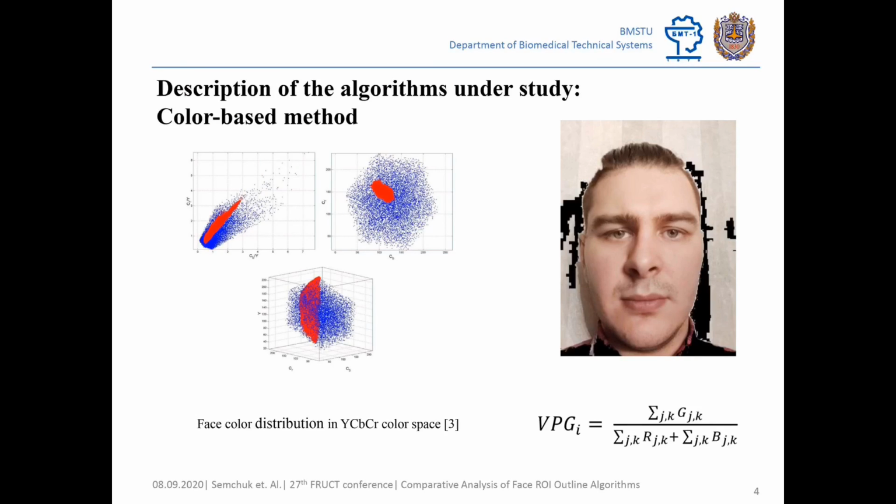The area of color space which contains the distribution of human skin colors is quite limited. Thus, segmentation of the required face area can be reduced to pixels belonging to a cluster defined by a parallelepiped whose borders are known and defined in literature.